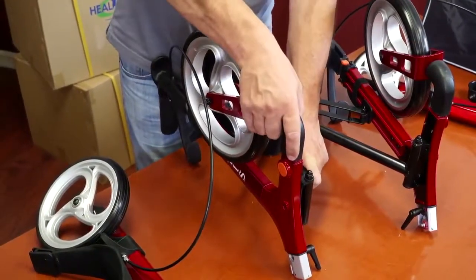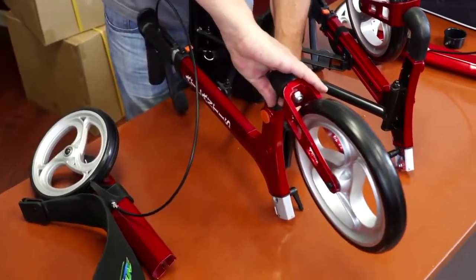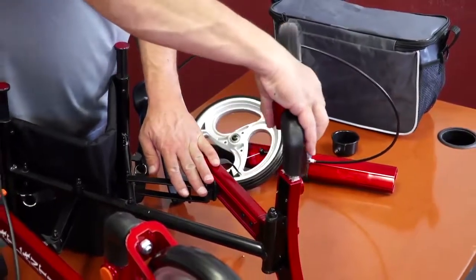To unfold the wheels, first pull the wheel up slightly, turn it 180 degrees forward on its axis, and snap it down into place. Repeat the same procedure for the other wheel.